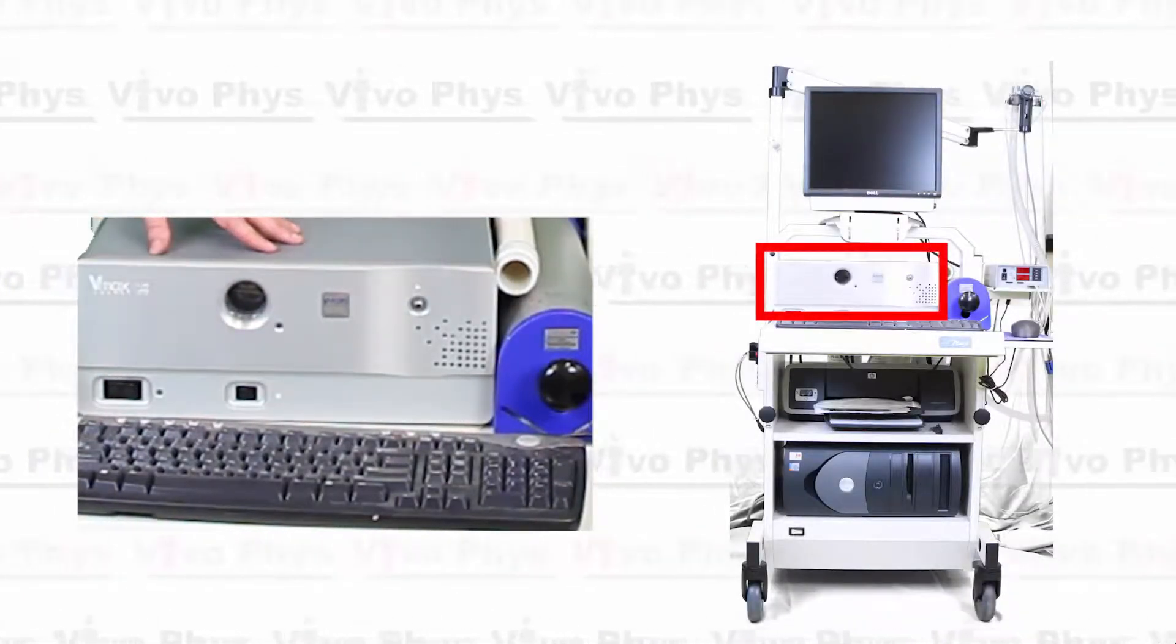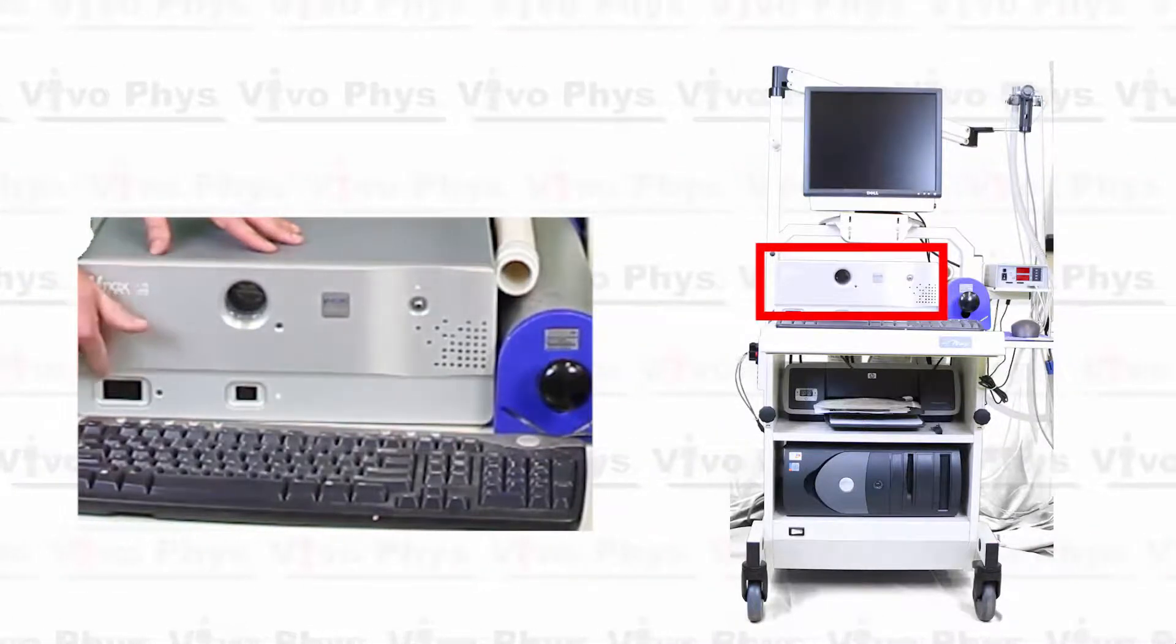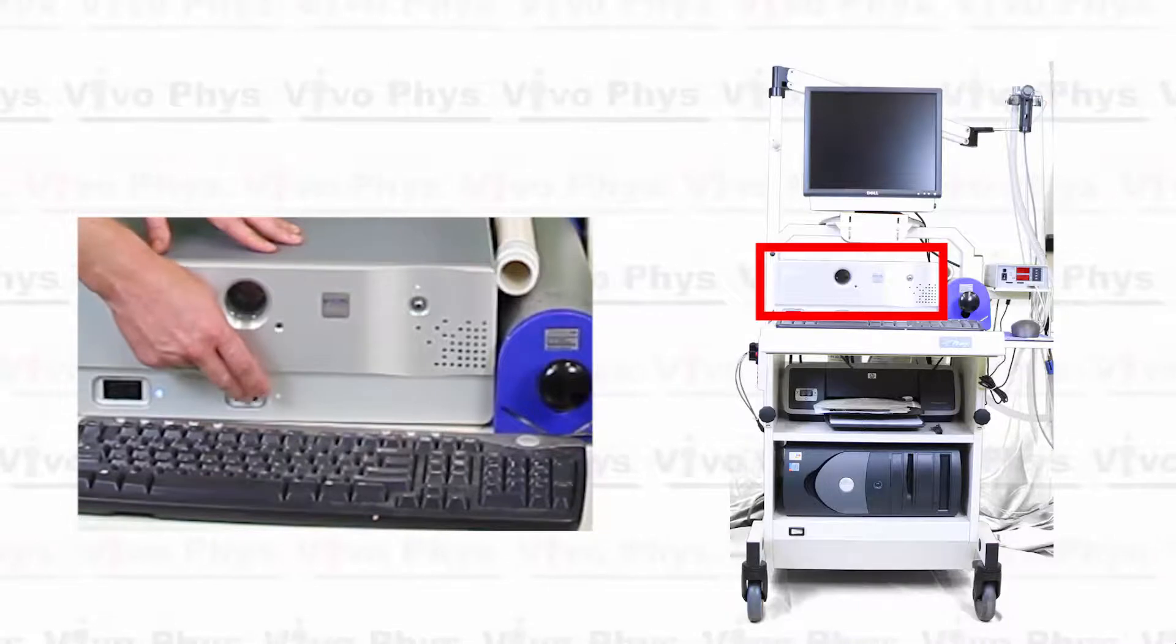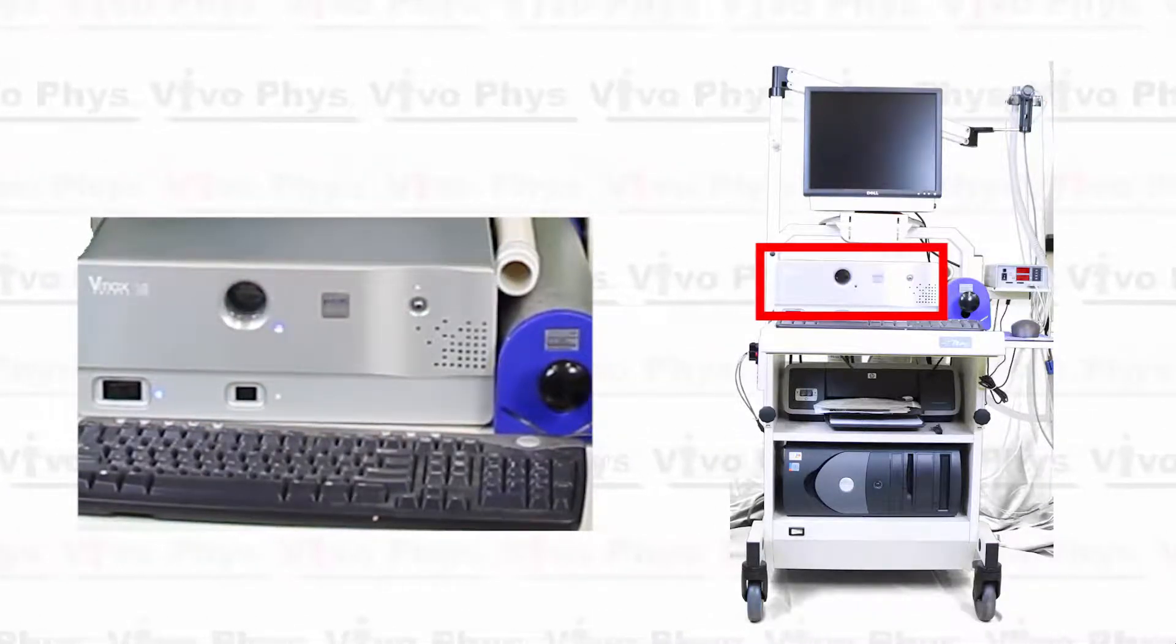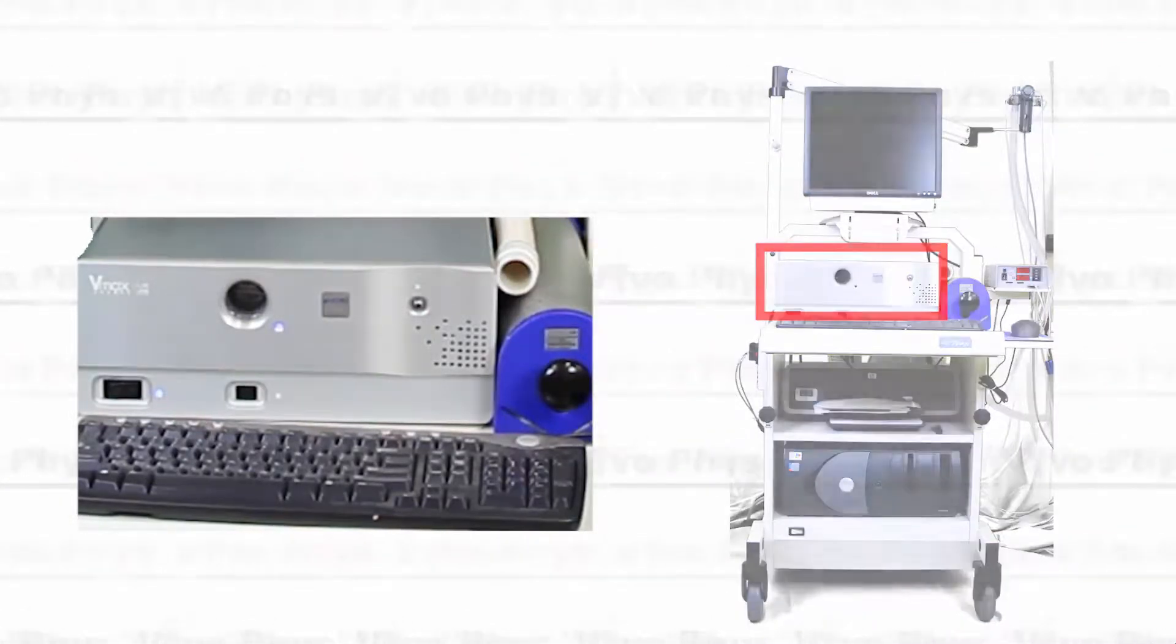So there's two switches here that we need to turn on. We'll go ahead and hit the first one first, so that's this power switch. And after that, we can turn on the fan itself, which is the second switch. Alright, so once these are on, we need to wait for at least 20 to 30 minutes before we actually try to calibrate the cart.